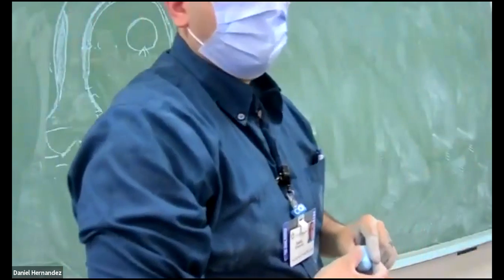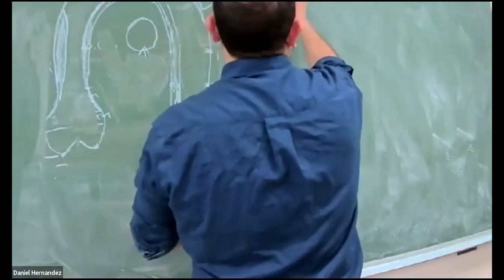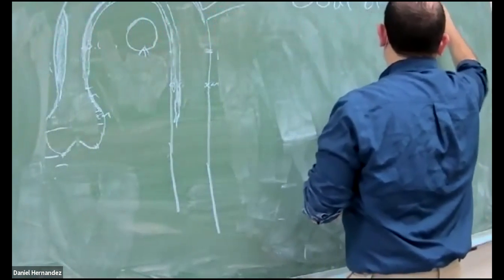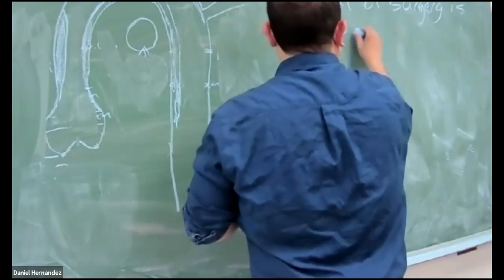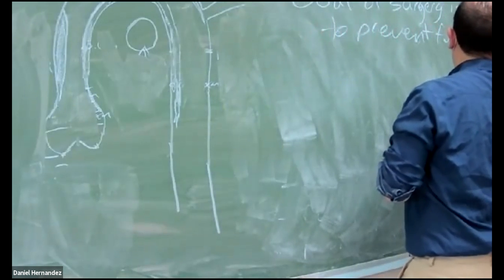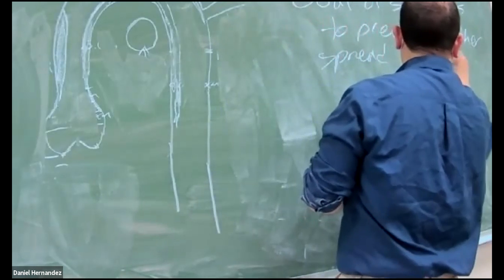So the use of echo following surgical repair. The goal of surgery is to prevent the dissection from spreading any further.